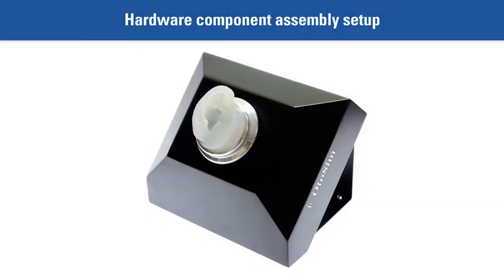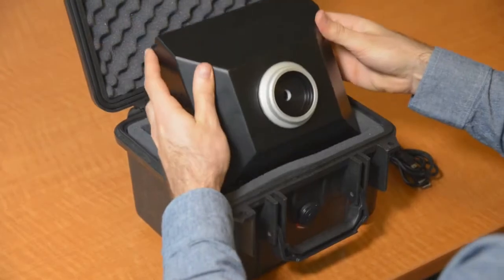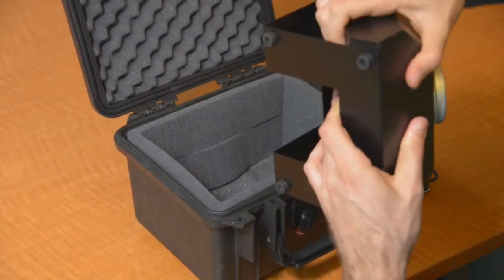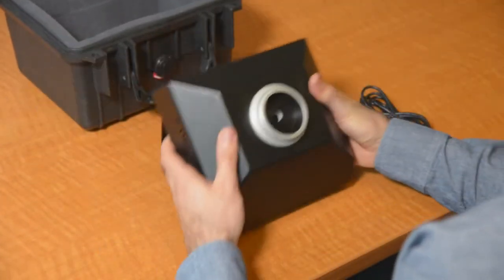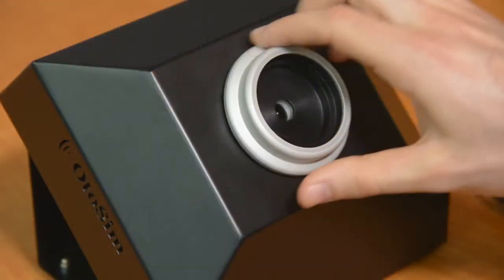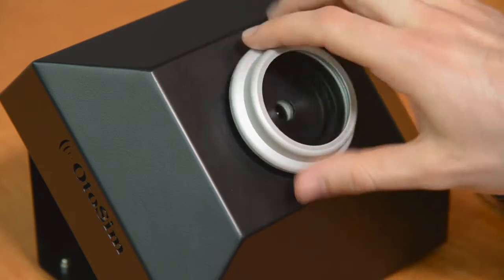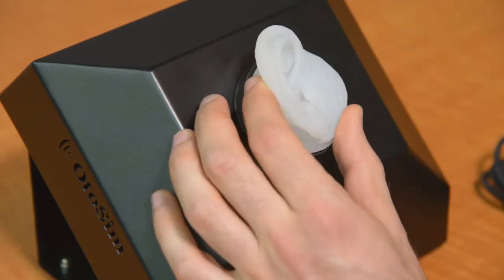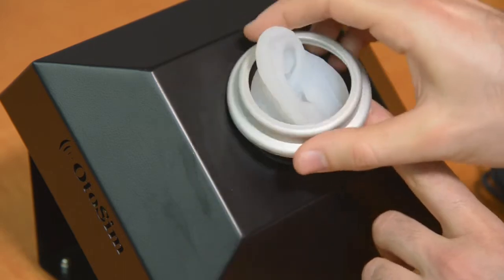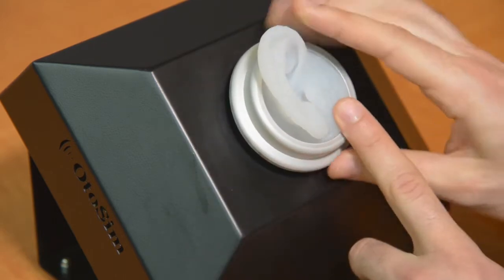Hardware component assembly setup. Upon opening the case for the first time, remove the base unit and place it on a flat surface with the rubber feet facing down. To attach the adult ear form to the base unit, remove the retaining ring from the display unit by turning it counter-clockwise. Place the ear form into the cavity and secure it by tightening the retaining ring.